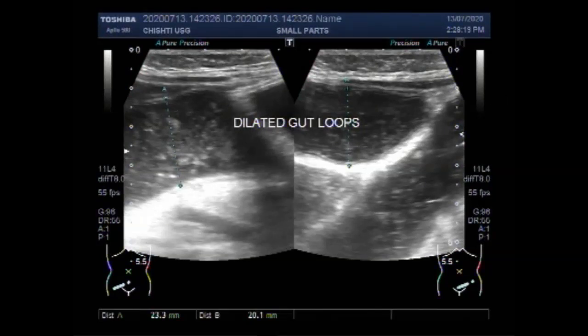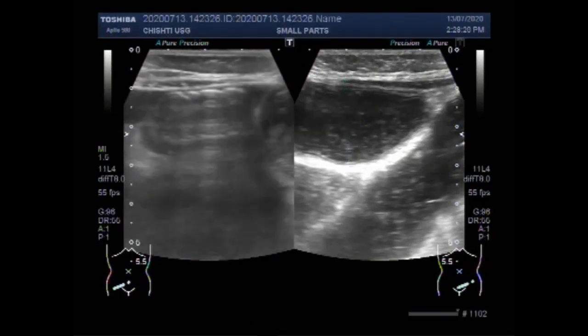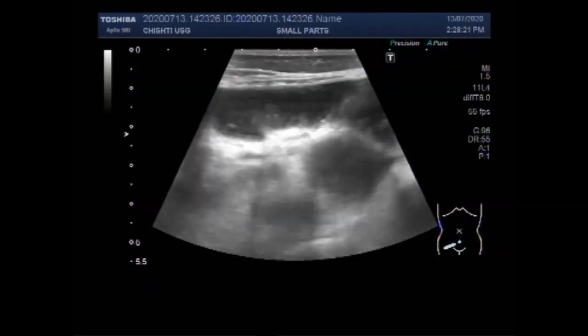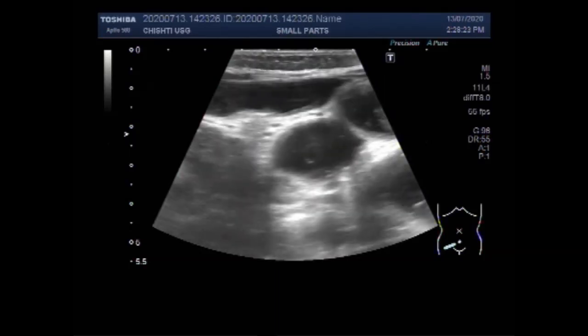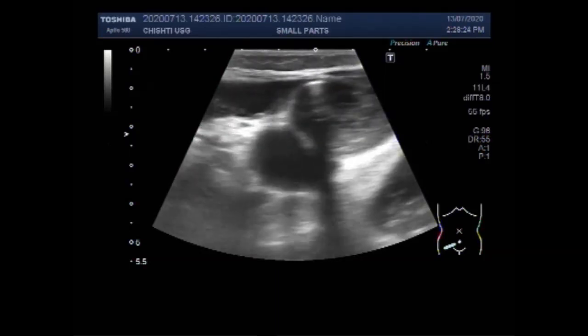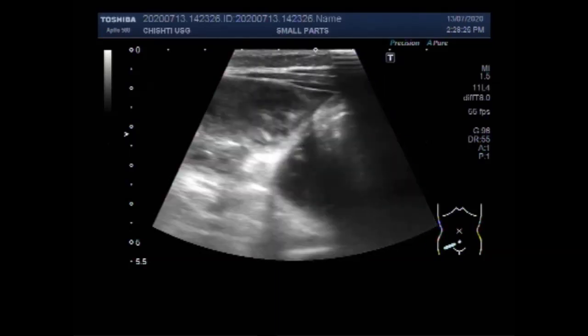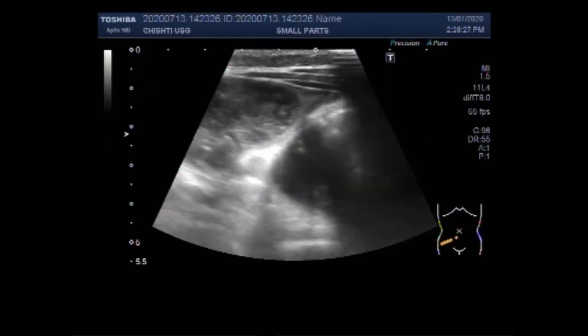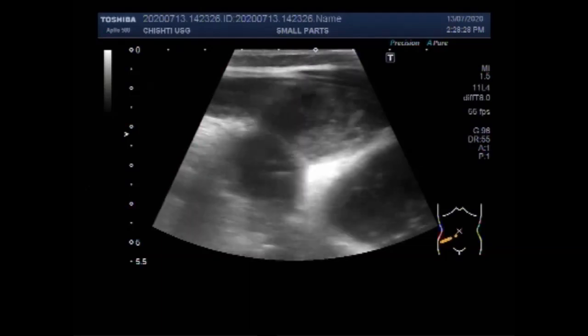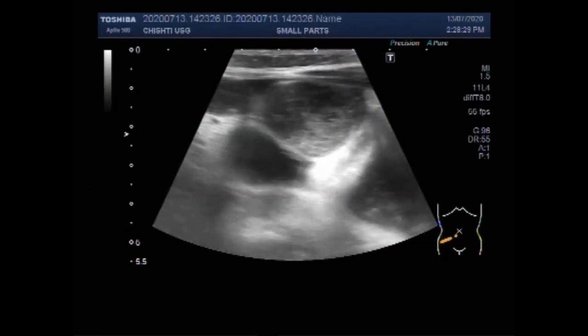Dear viewers, I hope you are all fine. This ultrasound video shows dilated gut loops with intestinal obstruction in a child of about 3 years.